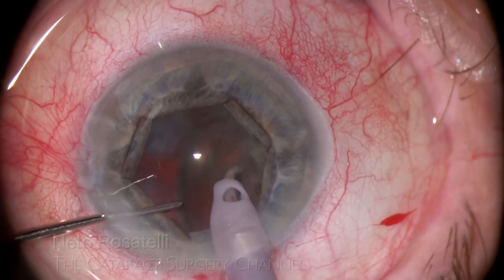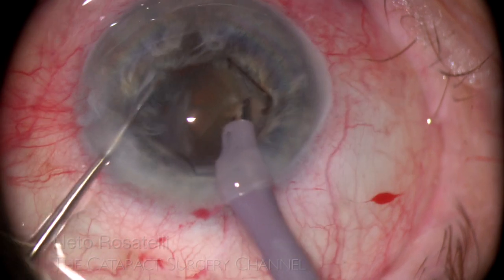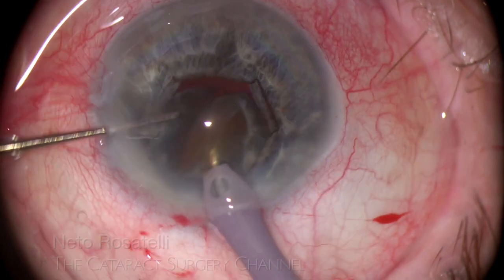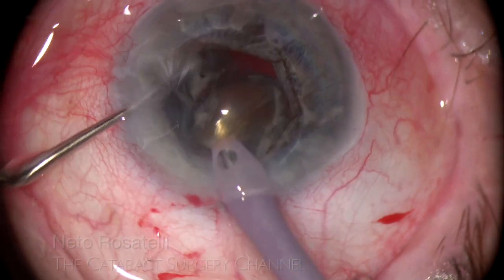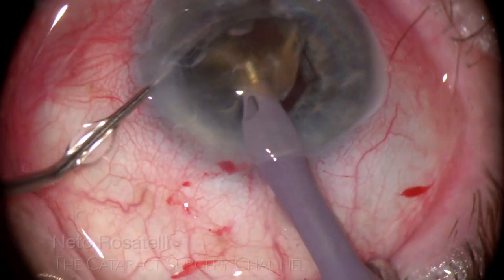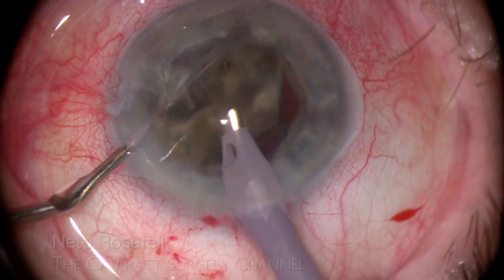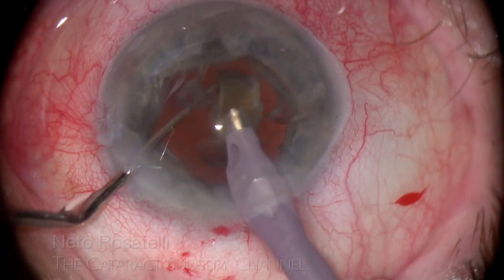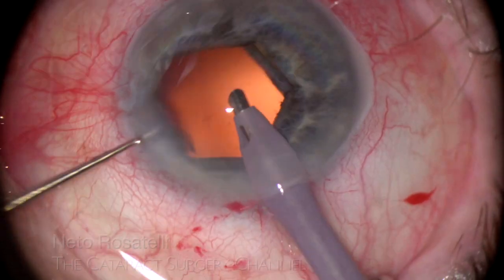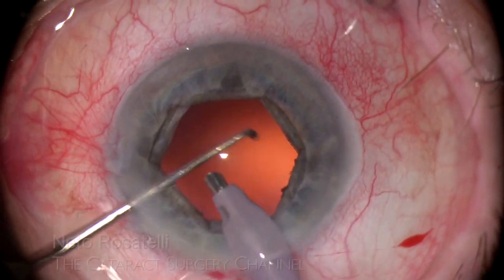At the same time I keep an eye on the bag, because it is practically completely detached now, but no vitreous is coming. I am confident to proceed this way because it is evident that the anterior hyaloid is intact and no nucleus fragments will fall into the vitreous cavity, else vitreous would have presented by now. The B-hex provides extraordinary safety, allowing me to work these big nucleus pieces without risk of iris damage. The bag is aspirated among the remaining nucleus fragments and I check to see if there is anything hidden in Berger's space.